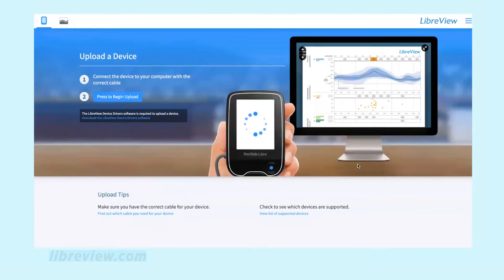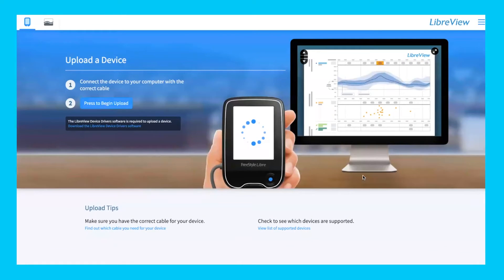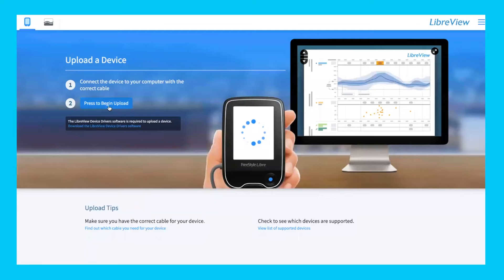The next page takes you to your upload page. First, if you haven't already, download the LibreView device driver software. This software downloads to your computer and allows it to communicate with your Freestyle Libre. If you already have that downloaded and installed, once you plug in your Freestyle Libre, you just need to press 'Begin to Upload.' It'll take you to another screen showing the upload beginning, and once it uploads, it'll take you to the next screen.